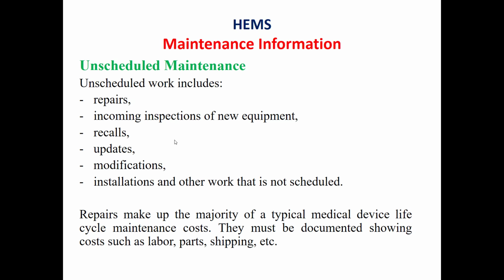The unscheduled maintenance work includes repairs, incoming inspection in case new equipment has been delivered to the hospital, hazard alerts and recalls, updates for the equipment, modification of some equipment, installations, and other work that is not scheduled.